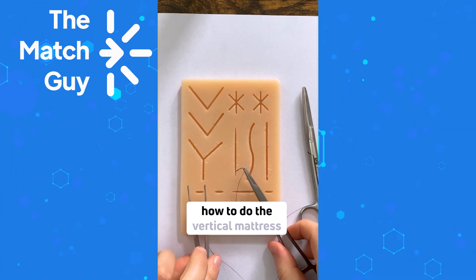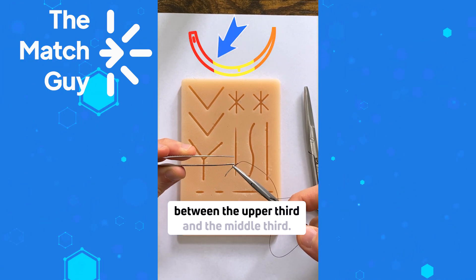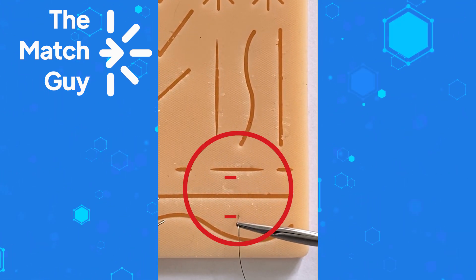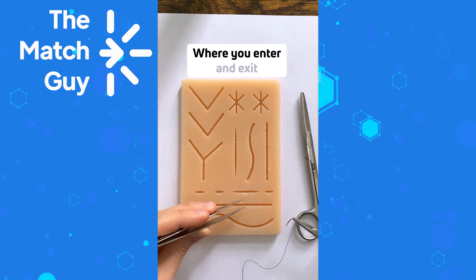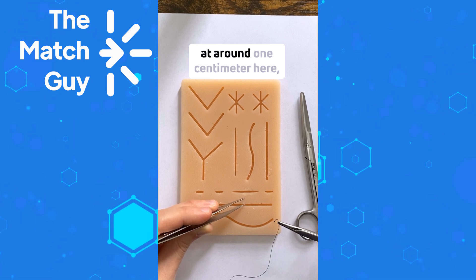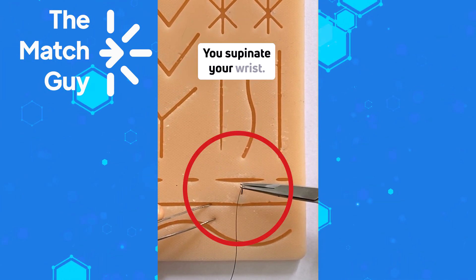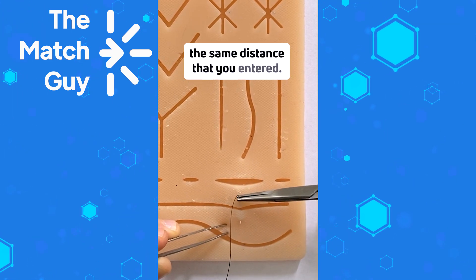Now let me show you how to do the vertical mattress. You load the needle like before, between the upper third and the middle third. We're going to go in far and come out far, then go back in close and come out close on the other side. Where you enter and exit will depend on how much eversion you want. Let's say you start at around one centimeter — so you start around here at a 90 degree angle like before.